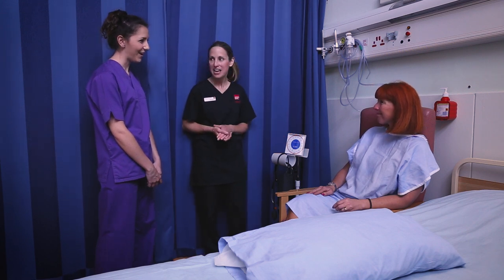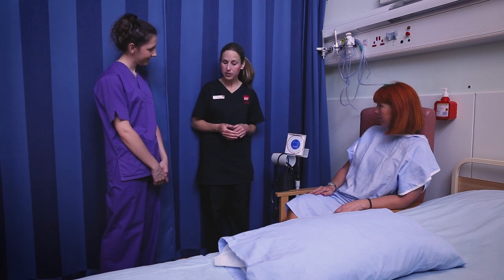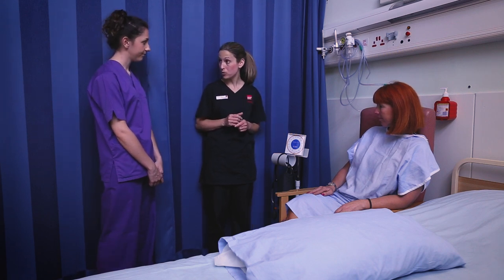Maria is our patient. So what we're going to do — I'm going to demonstrate this skill on Maria. Before we undertake the procedure we'd obviously wash our hands and make sure we gain consent from the patient before we undertake the task.